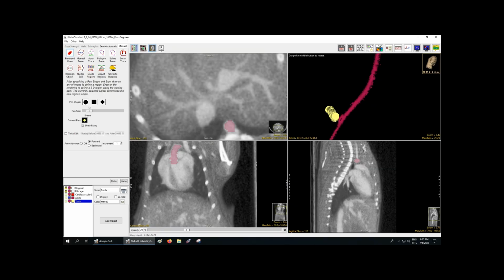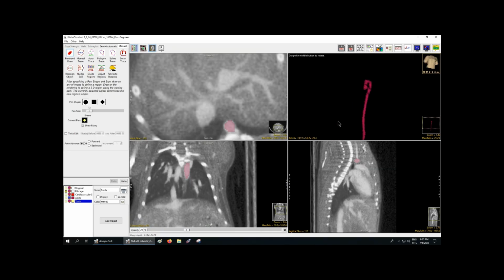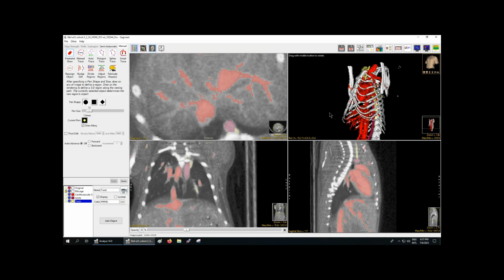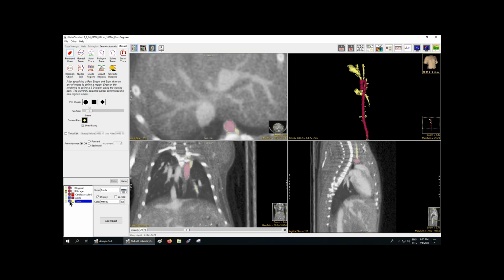And you can see that this is the first very rough draft of the aorta that you have extracted out of the cardiovascular system and the ribcage. Now that was pretty simple, wasn't it? Hide, and hide. There we go.